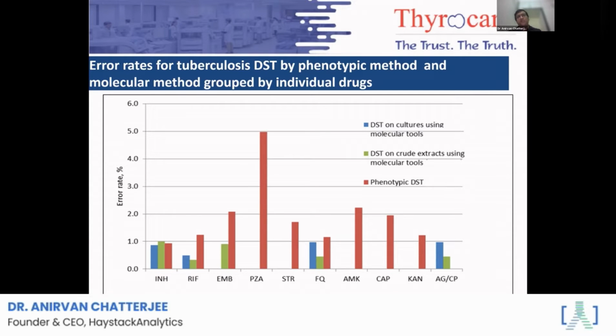because there is no one single method which is perfect for finding out this drug susceptibility. When we compare the molecular tools versus the phenotypic DST, we find that even phenotypic DST has sometimes a much higher error rate for a few drugs than the molecular tools. And we also understand that there are some phenotypic DSTs which are really, really gold standard and probably cannot be replaced by a molecular tool.